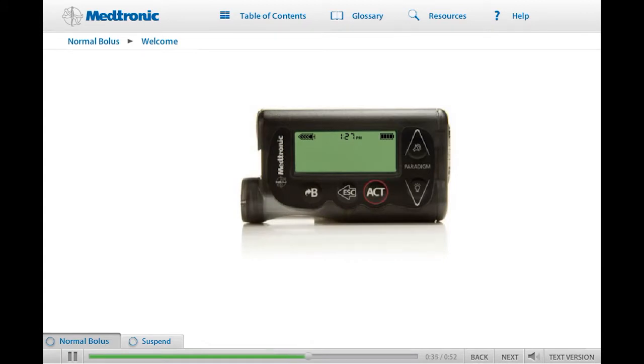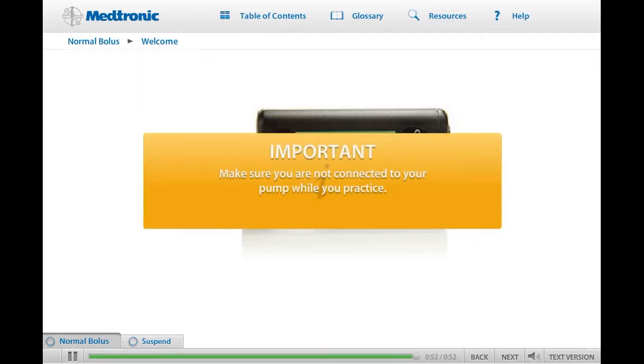This training is intended to supplement the personalized training provided by your health care provider. If you have your pump available, we encourage you to follow along and practice the training exercises before you attend your in-person pump training. Make sure you are not connected to your pump while you practice.